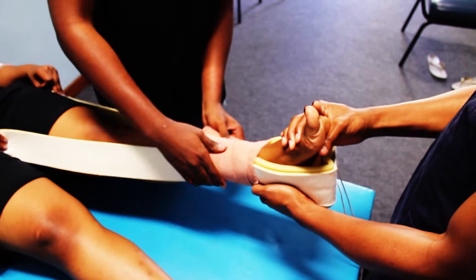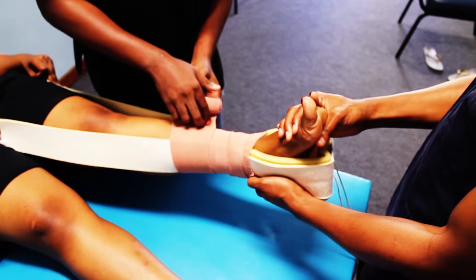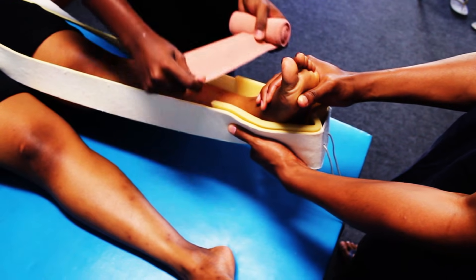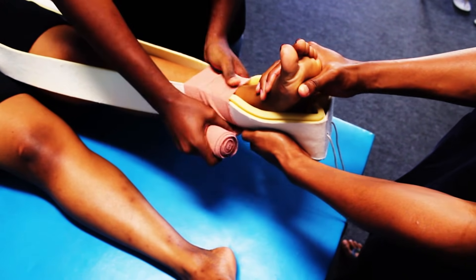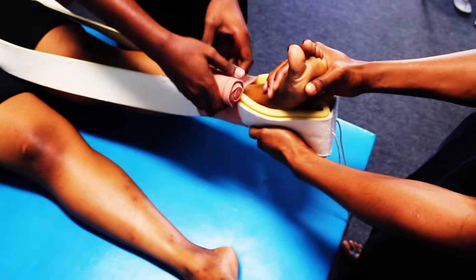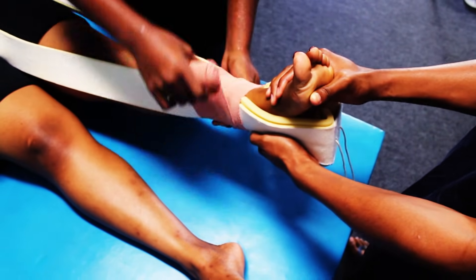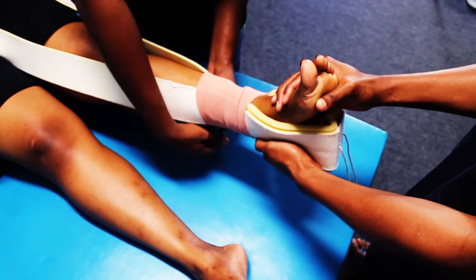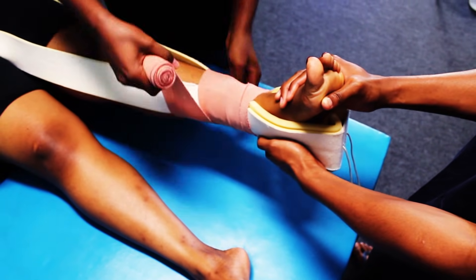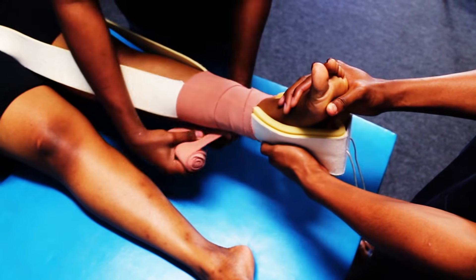The technique demonstrated here is the 50% overlap method. Alternatively, you can use the figure-of-eight method, which ensures more tensile strength. Apply all the way up to the level of the groin, making sure it's not too tight to prevent the development of compartment syndrome.